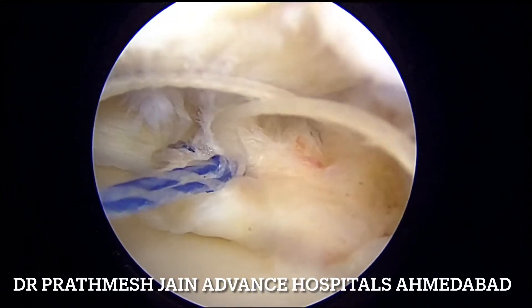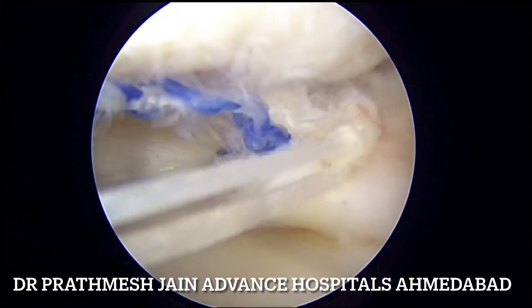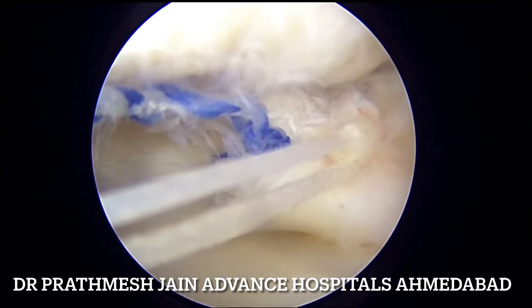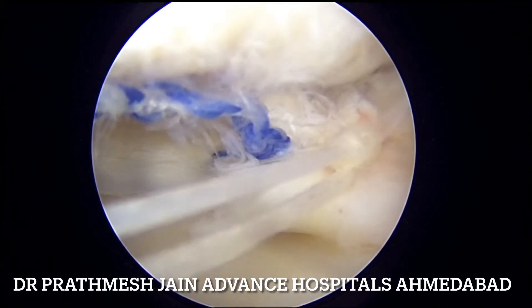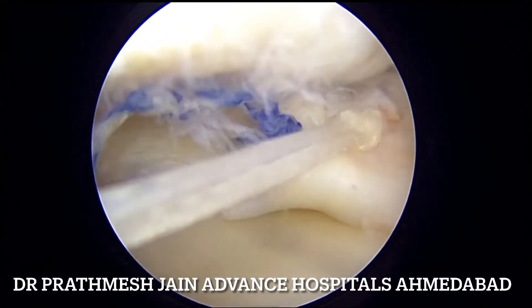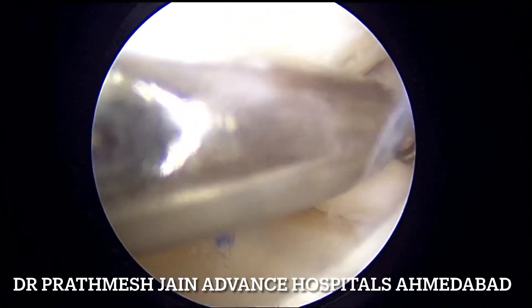We will first tie the blue suture and after that we will tie the white suture. Once both of these sutures are tied, the radial component and the complex component are addressed. Then we need to reduce the other part — the predominant component of the bucket handle tear — which we will address by an inside-out technique.